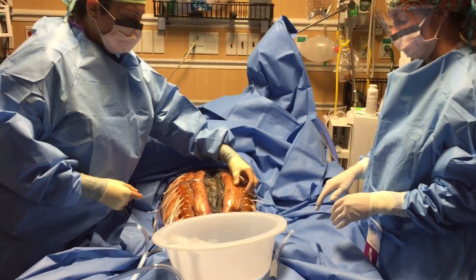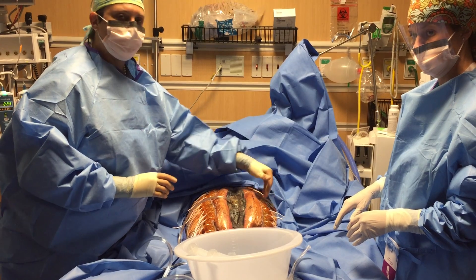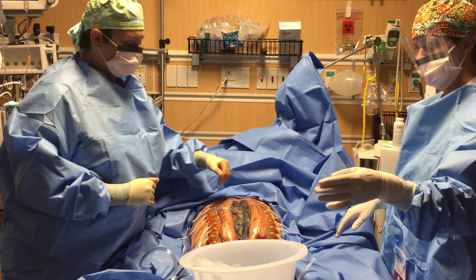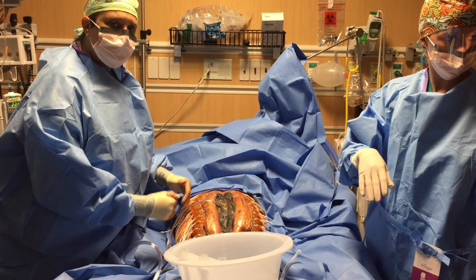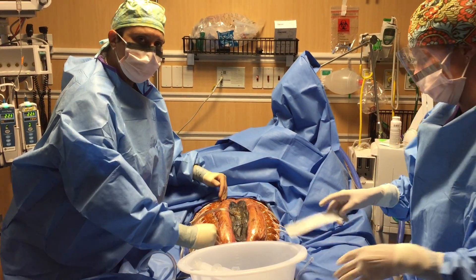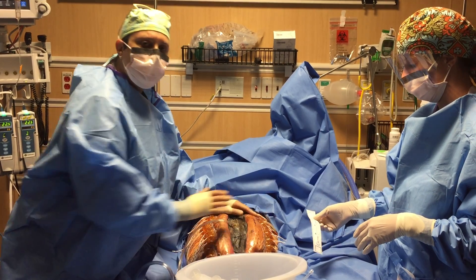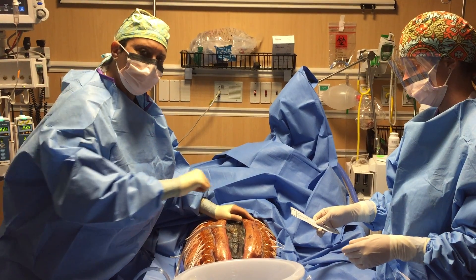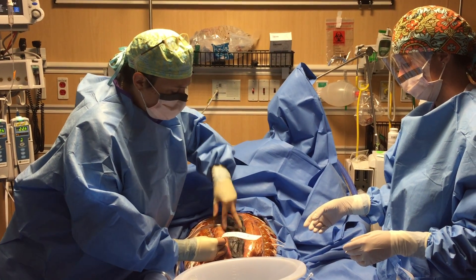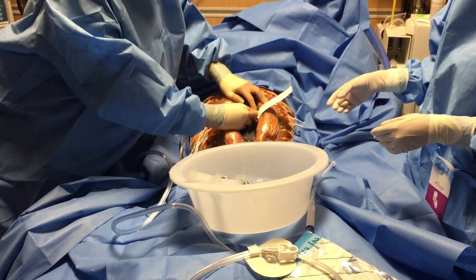Let's have the wound vac off. I'll show you the measurement here and again when we take the wound vac off. If you have an ostomy or any other device on one of the patient's sides, you want to adjust the elastomers on the opposite side only — all adjustments are being made on this side only. The reason is you don't want to continue pulling up against your drains, because that silicone barrier underneath is going to wrinkle up and start pushing against these tubes. You want to go fascial edge to fascial edge — not the skin edge. Right now this is measuring at six and a half centimeters.